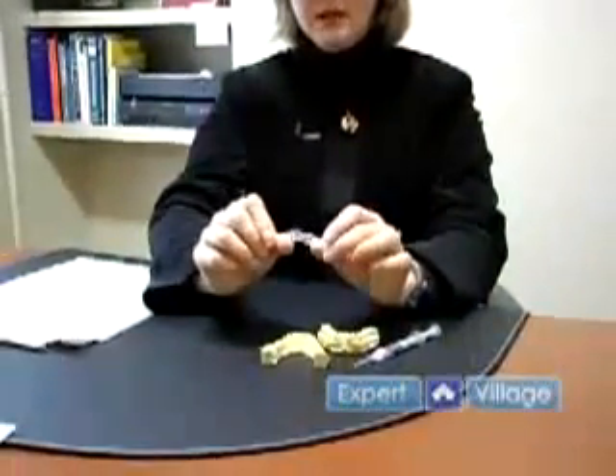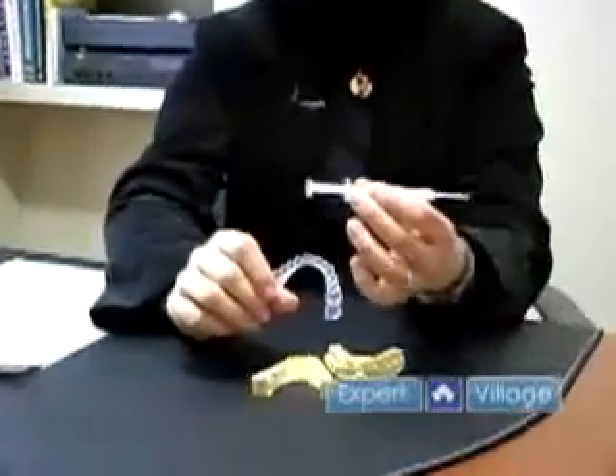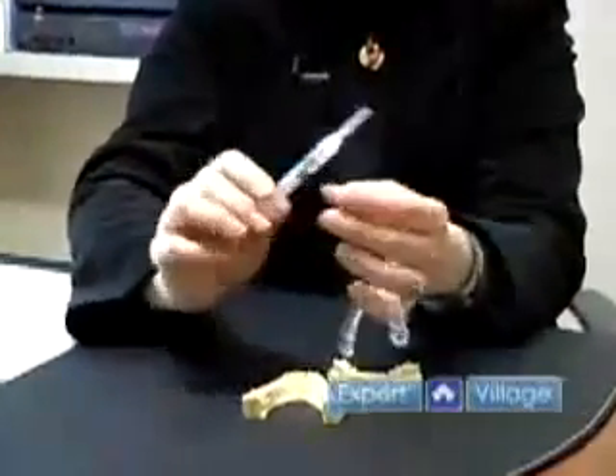Should you and your dentist have decided that you're a good candidate for take home whitening and you've had bleaching trays made, when you get home to use these, you will have also been given some tubes of whitening gel.